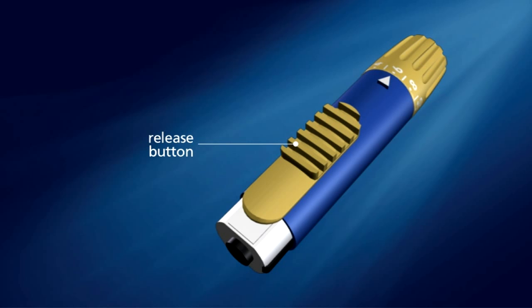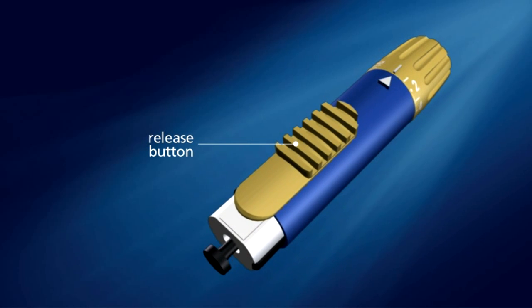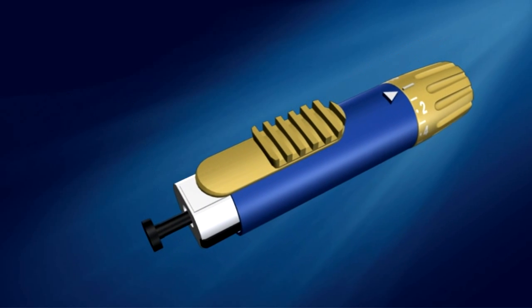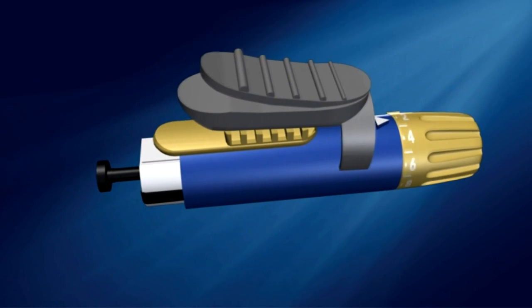The release button is used to inject insulin into your pet after inserting the needle through your pet's skin, as instructed by your veterinary professional. Pressing and holding the release button releases the internal plunger, which causes insulin to be expelled through the needle. The release button extension may be used to provide a better grip when giving injections.